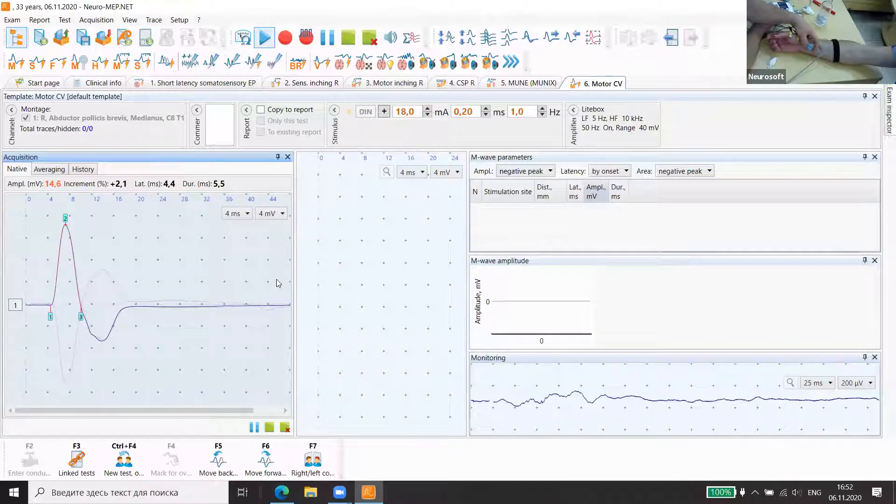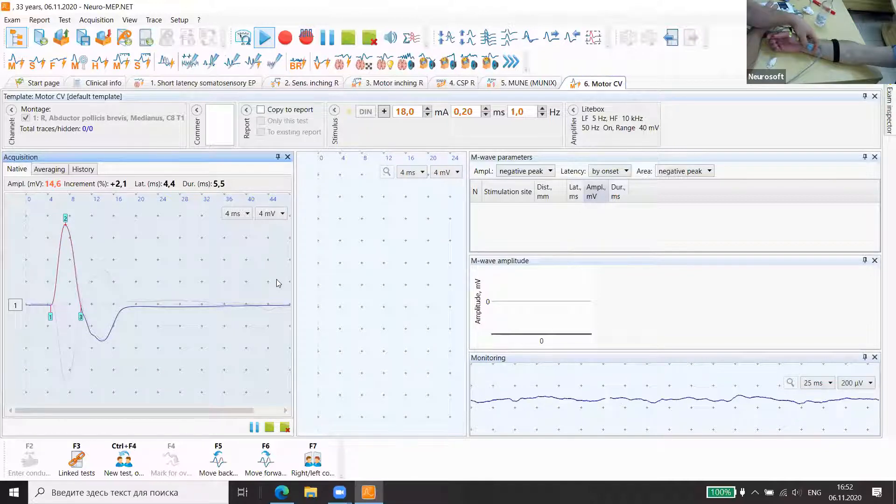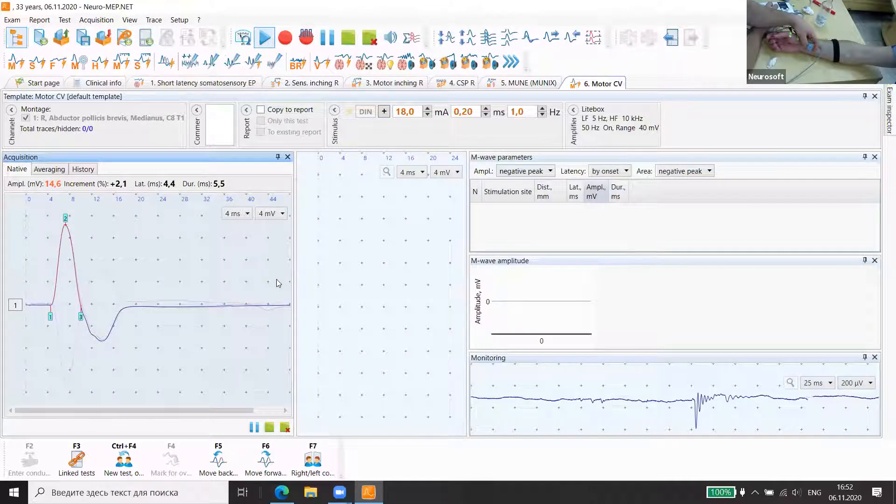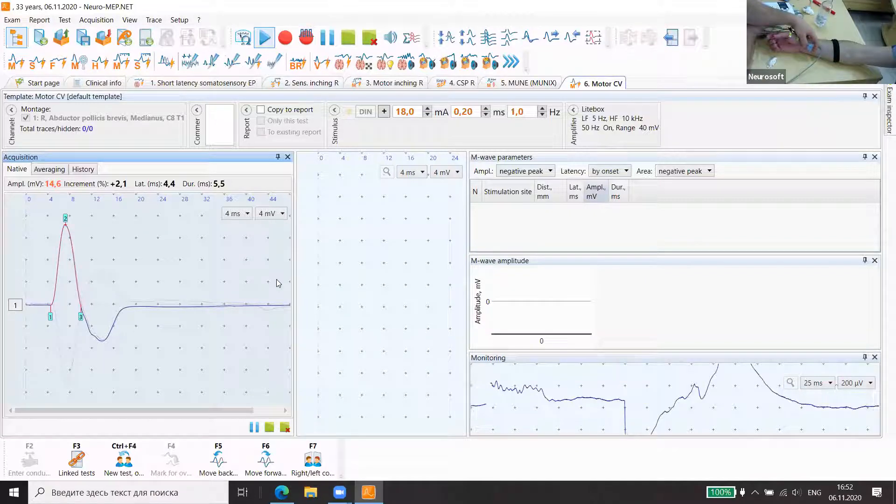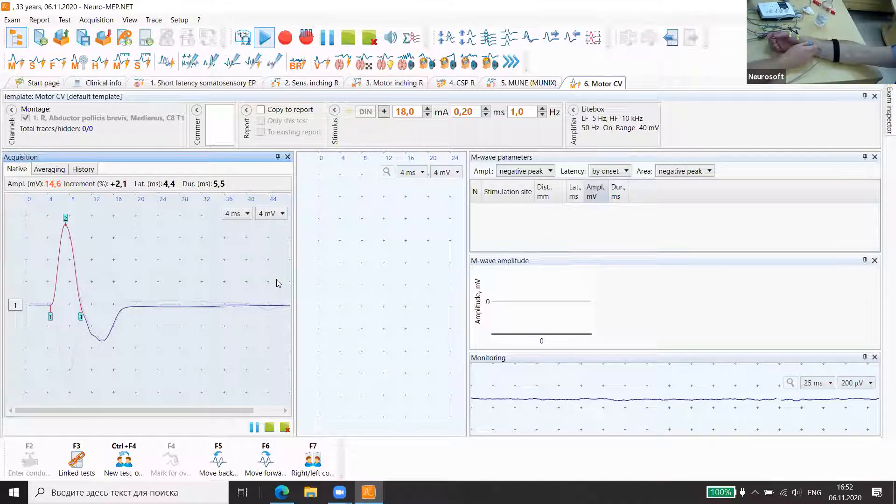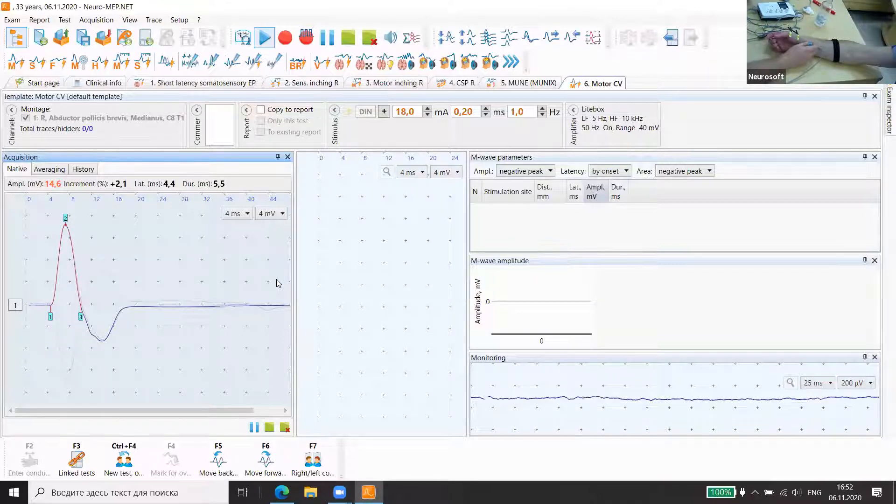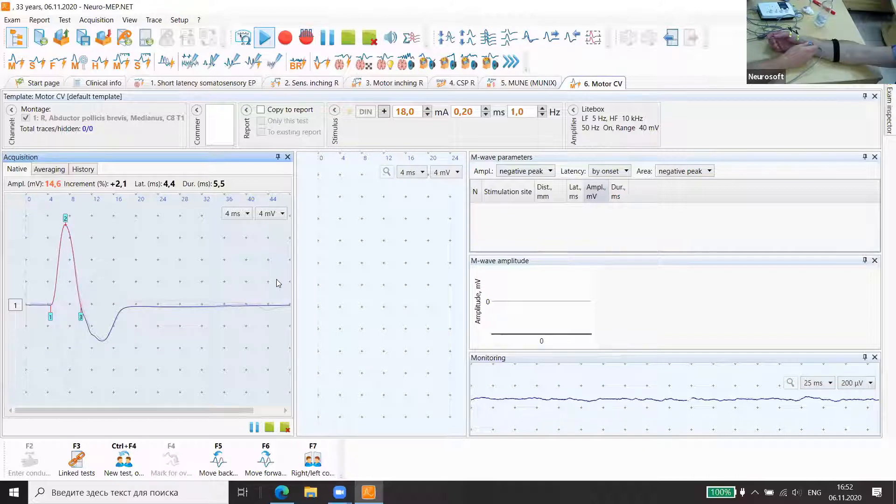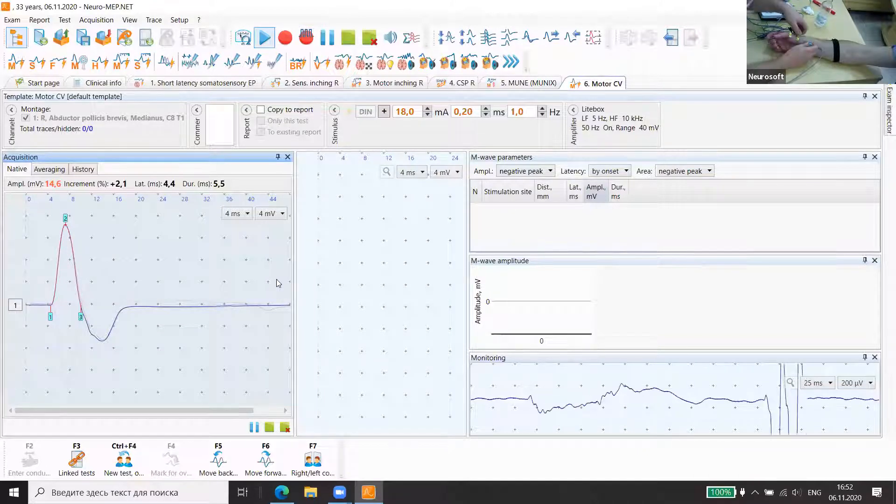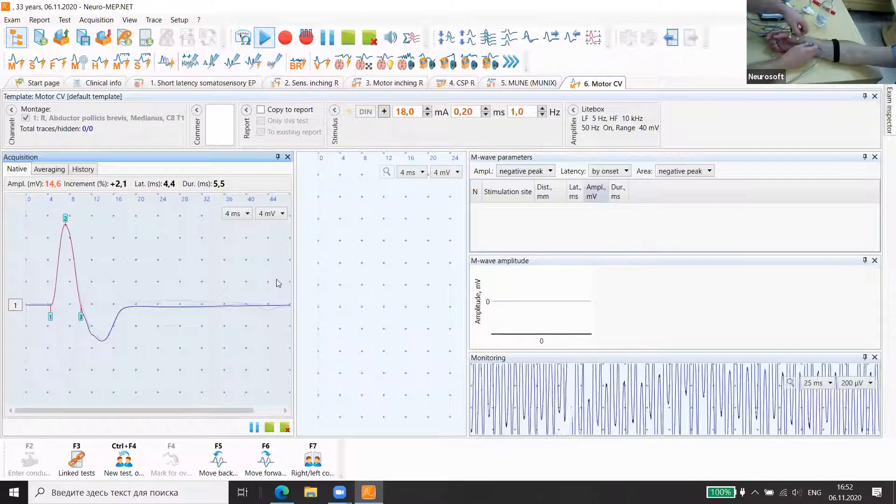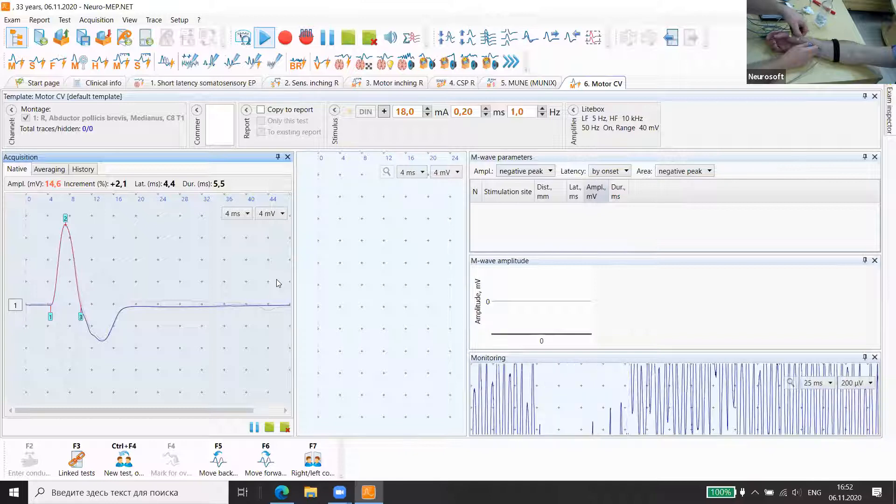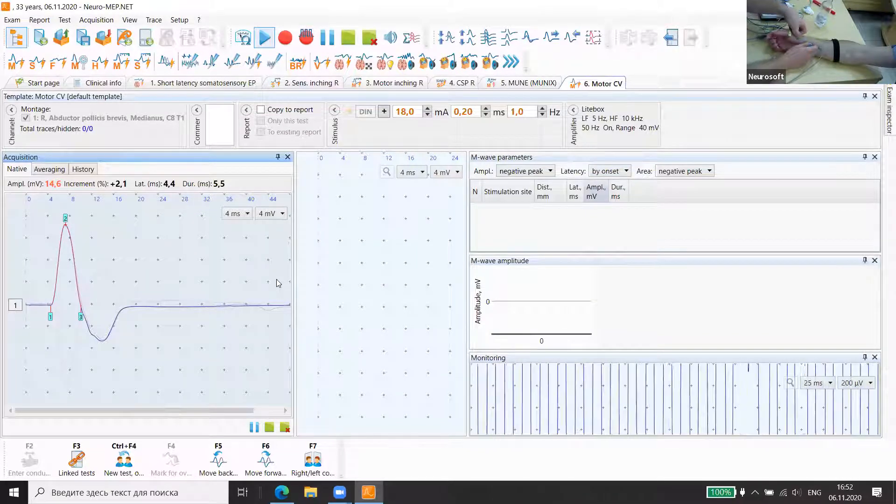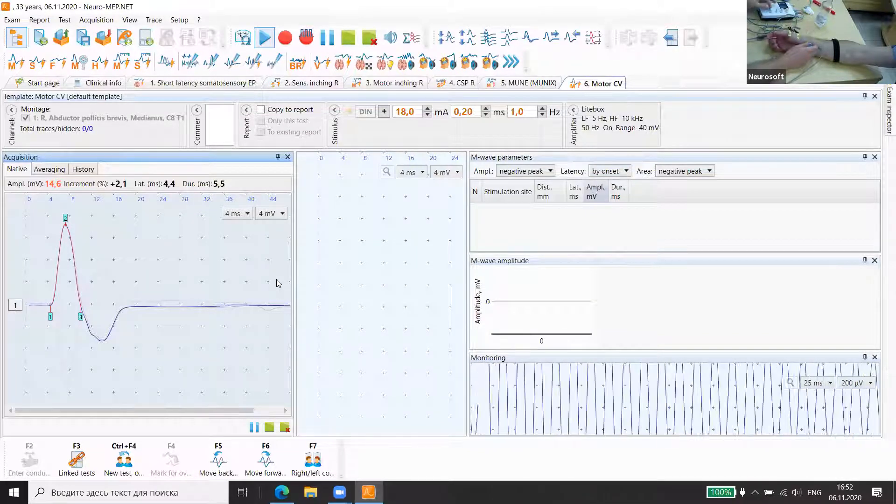Now for the MUNIX method, it's very important to get the highest level of CMAP compound muscle potential. We usually change several times the position of electrodes to find this place.